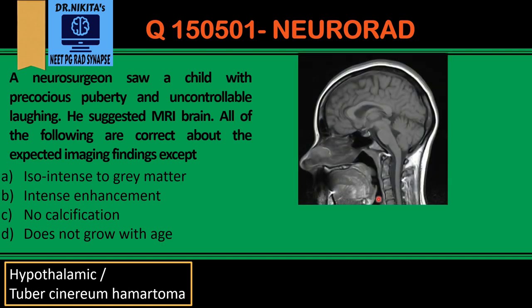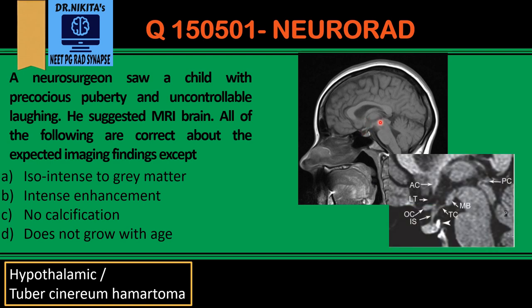First, where is the tuber cinereum? This is the region of the hypothalamus. Looking at the zoomed image: that is the mammillary body, this is the pituitary gland, this white thing is the posterior pituitary, leading to the infundibular stalk. Between the infundibular stalk and the mammillary body is the region of the tuber cinereum of the hypothalamus — this is where the hamartoma occurs.